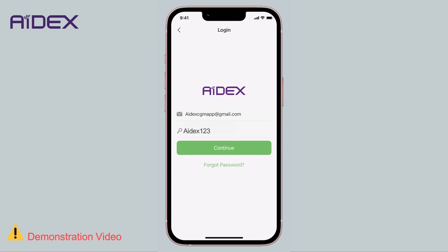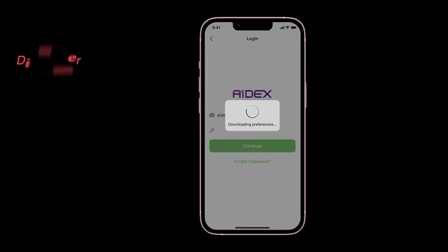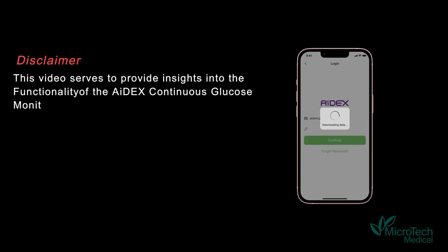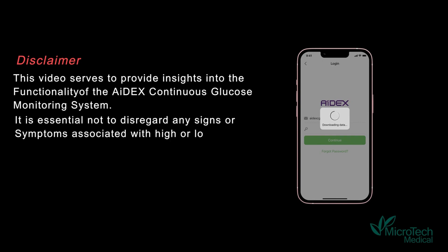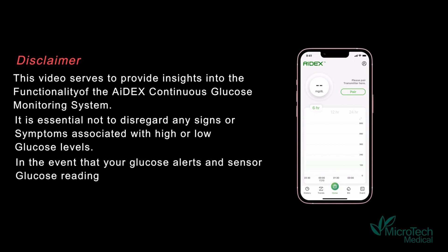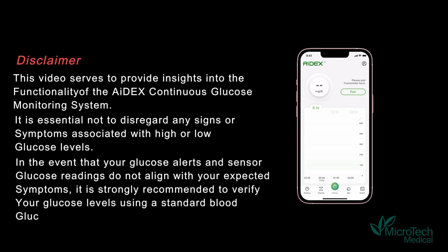Note: AiDEX allows you to open the app on only one mobile device at a time. If you log in on one device while the app is open on another device, it will automatically log out from the second device for security reasons. This video serves to provide insights into the functionality of the AiDEX continuous glucose monitoring system. It is essential not to disregard any signs or symptoms associated with high or low glucose levels. If your glucose alerts and sensor readings do not align with your expected symptoms, it is strongly recommended to verify your glucose levels using a standard blood glucose meter.